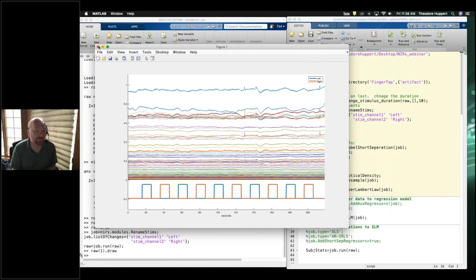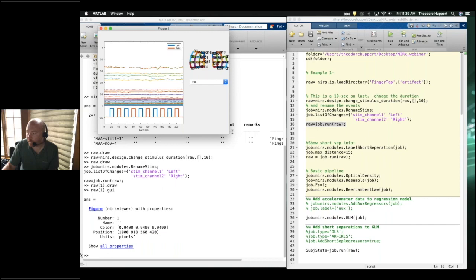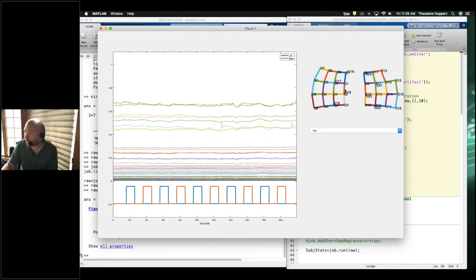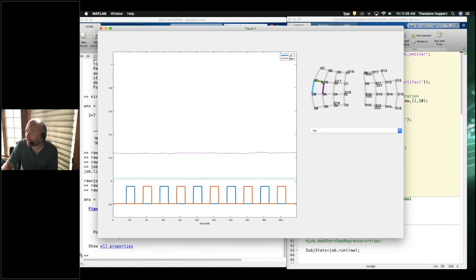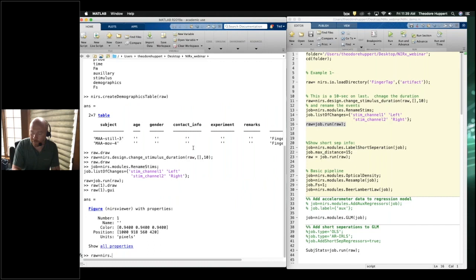I'll show a couple of other options I've added recently. There's a function called GUI — if you say raw.gui it gives a graphical interface where you can click around, set all channels off, view just some of the data, similar to the HOMER interface. You can change which wavelengths you're looking at.